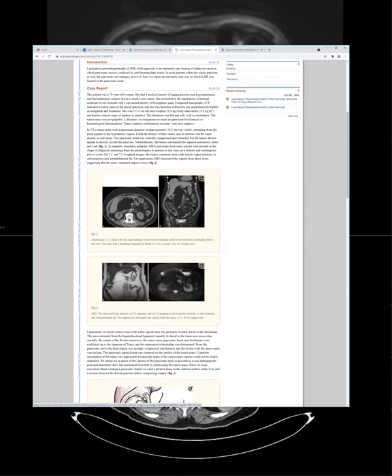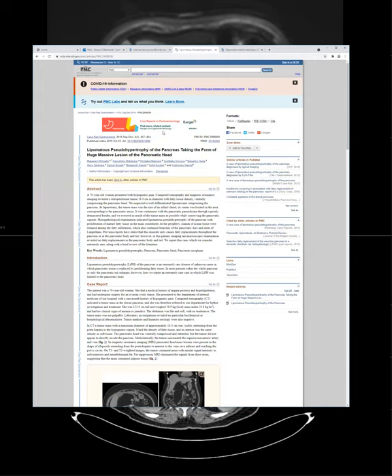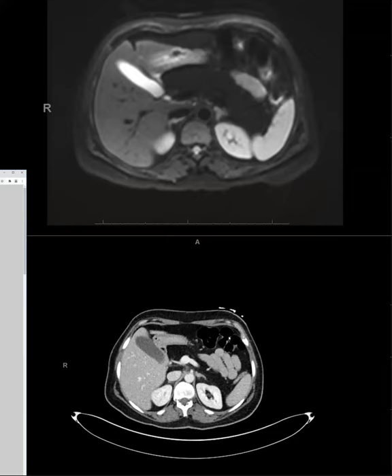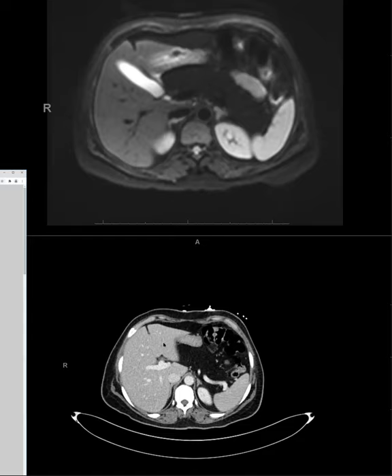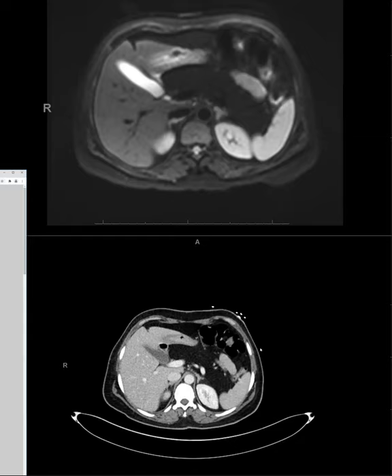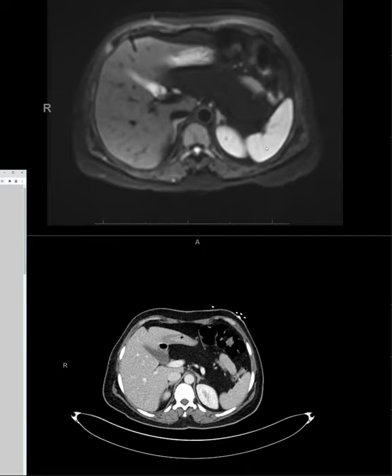But if you look at other cases, like if you Google lipomatous pseudohypertrophy, you get a bunch of cases that look like this. They're all case reports. Cool. And you don't know what causes it. No, it's rare, idiopathic, and they just basically treat the exocrine deficiency. There's no endocrine deficiency. So somewhere in here, there's islet cells. And the skeleton of the pancreatic ductal system is still there too, apparently. Yeah, I just Googled it and it said usually that the islets are preserved, which is kind of crazy. It's almost like somehow only the exocrine cells are being attacked.